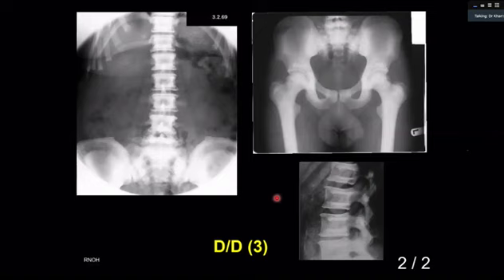Cyclic pattern means that there are cycles where normal bone deposition is there, and then there will be more sclerotic bone deposition, and it goes into cycles. People don't know why it happens like this. But this particular sign gives you some leeway to diagnose it.